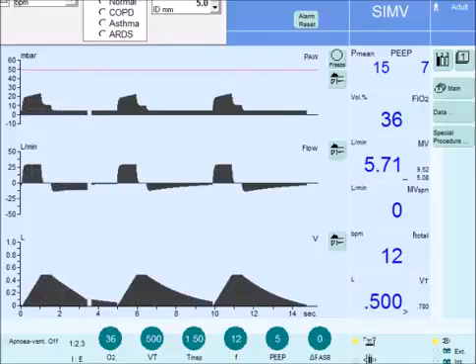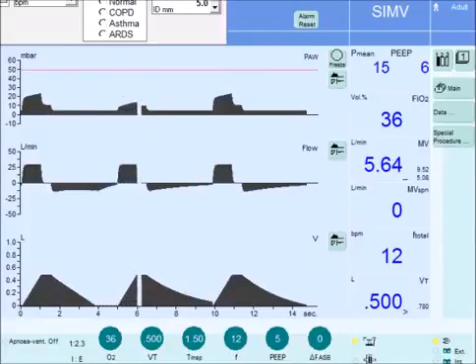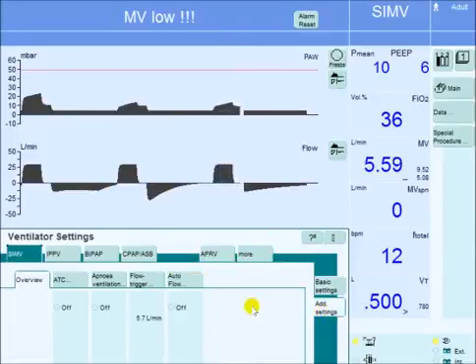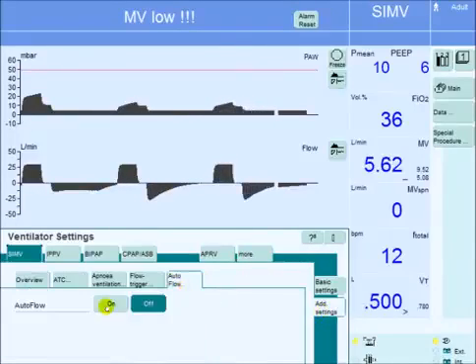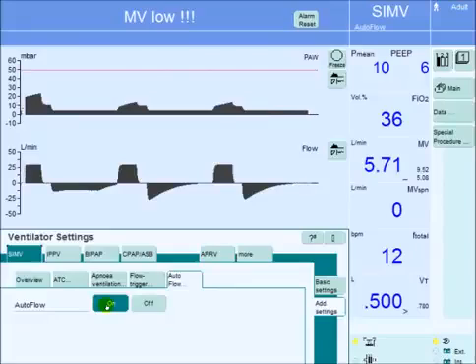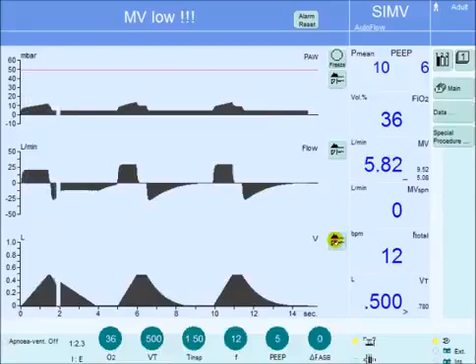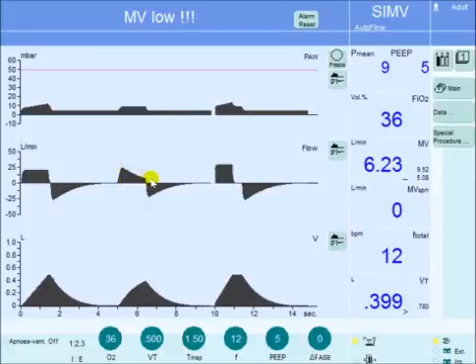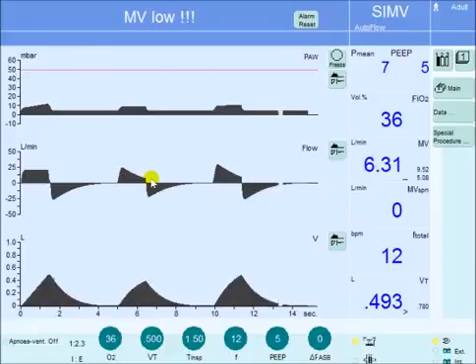Now, in pressure-regulated volume-controlled mode of ventilation, you can turn that on on Draeger by going to the Add Settings, Auto Flow, and turn it on. Notice that when you turn the Auto Flow on, the flow waveform is changed from a square wave to a decelerating wave, indicating that this is a pressure-delivered or pressure-regulated breath.